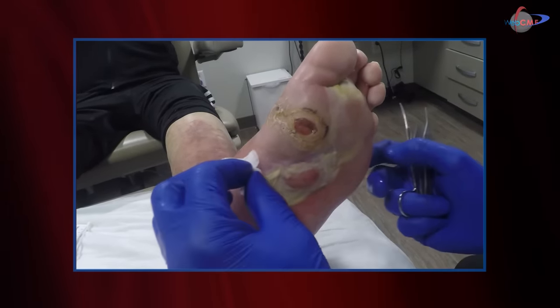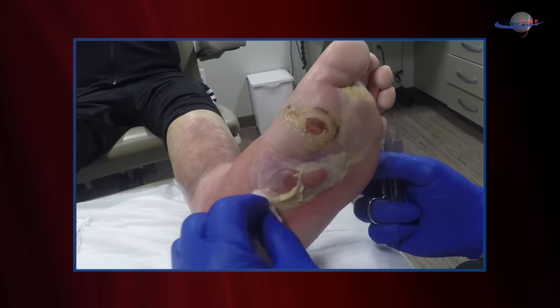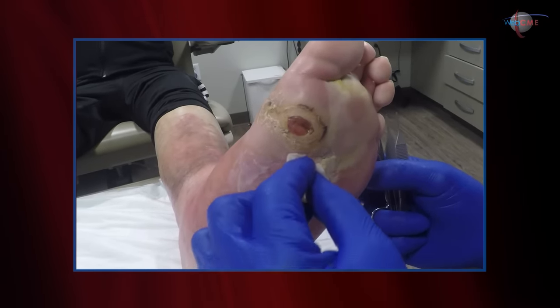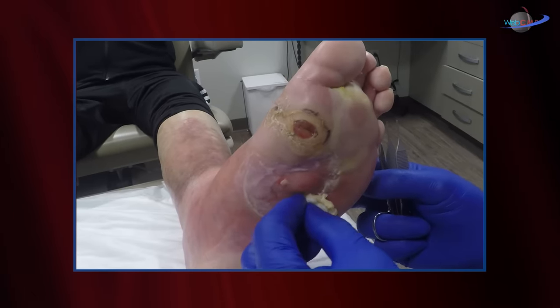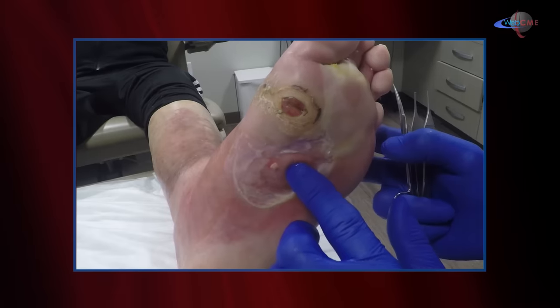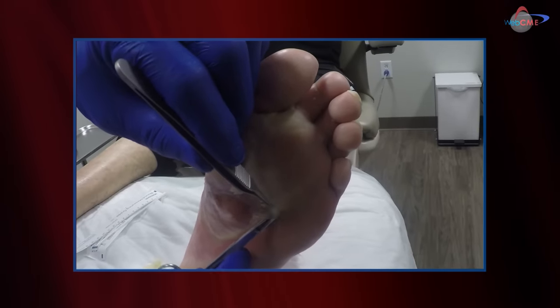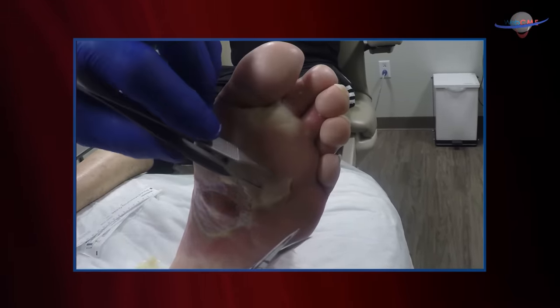That's the epidermis you see sliding off. Now I can look at this really closely, and in fact there's pus underneath there. I'm going to go ahead and open that in a second. Let's explore the rest of this. The most likely cause is seeding of the deeper tissues from the ulcer.